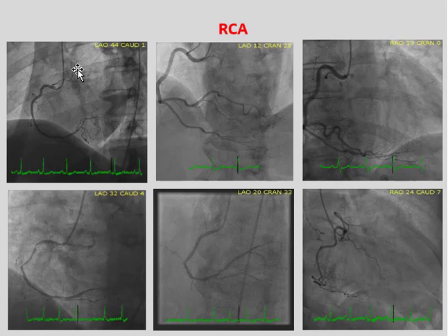Going back to the LAO, notice they always have a little bit of angulation in the other rotation because they're not going to be perfect every time. They're not going to worry about those extra degrees. And that tends to make our lives a little bit harder because look at this. LAO 12, cranial 29, LAO 20, cranial 33. They will be different. But going back to the straight LAO, that's the C shape that people seem to like. And you're looking at the heart end to end.